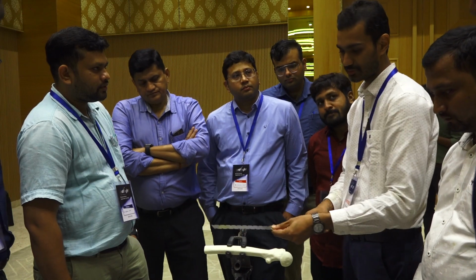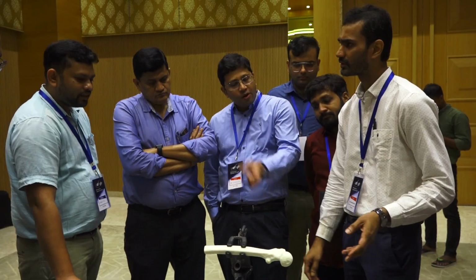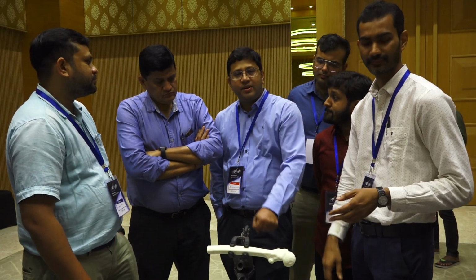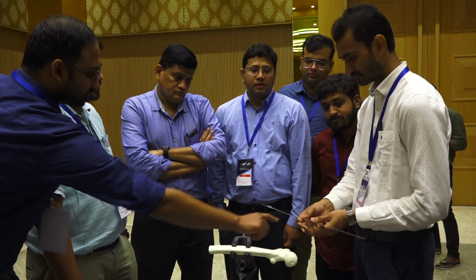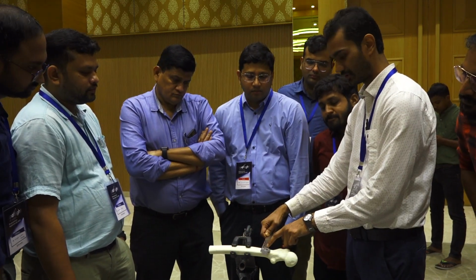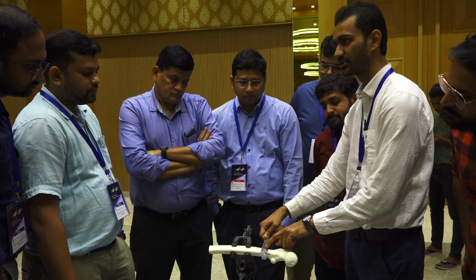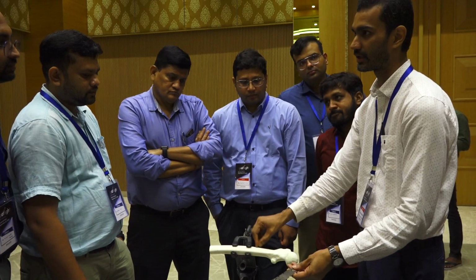So after taking the proper length and diameter of the nail, you have to... How would you decide on the diameter of the nail? Thickness of the nail? You put the ruler on this, check the inner diameter, 9 mm, 10 mm, whichever is matching at the isthmus level. Okay, the narrowest part of the canal.